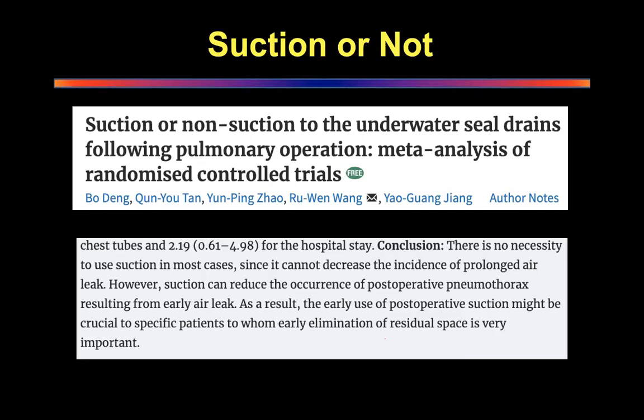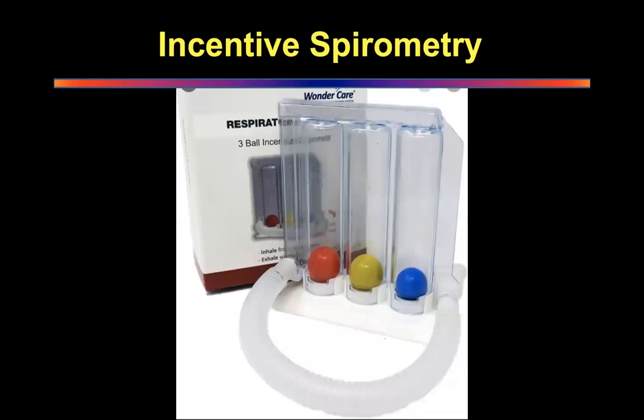Because I use a digital suction device, I know my suction cannot go wrong. The device works. And if the device is malfunctioning, then I'll take out the device and keep him without suction. That's okay with me.